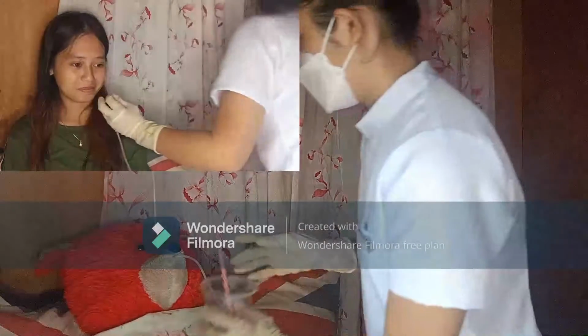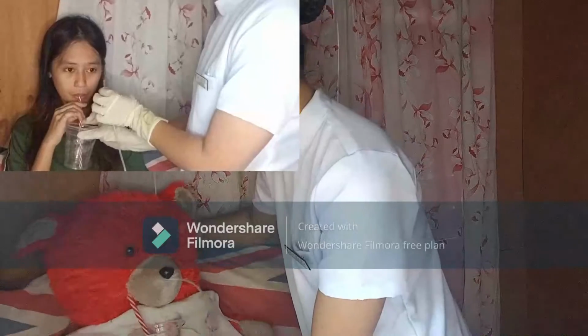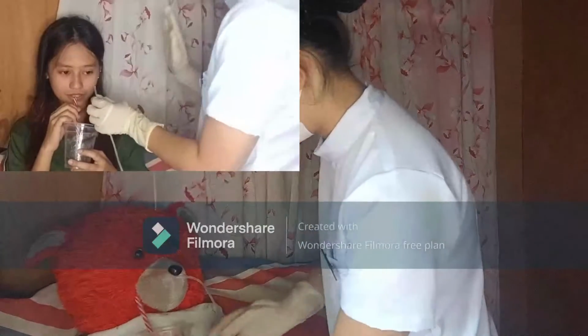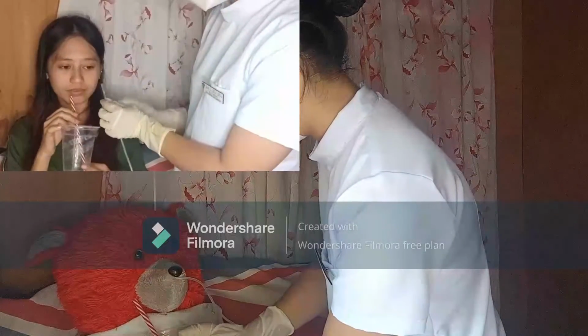If the client gags, stop passing the tube momentarily. Have the client rest, take a few breaths, and take sips of water to calm the gag reflex.